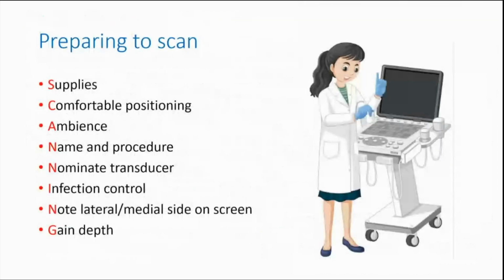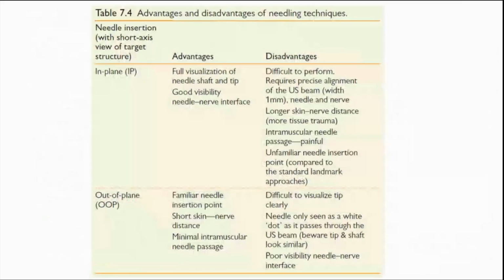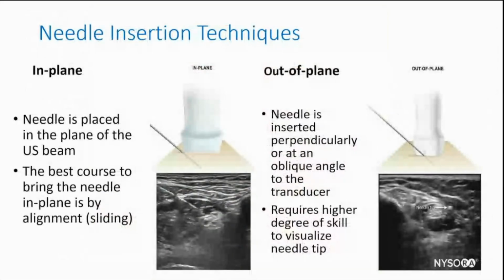If you look at the Sonosite, beside the power button, there's a button there that you can change the kind of view, whether it is resolution, general, or penetration.